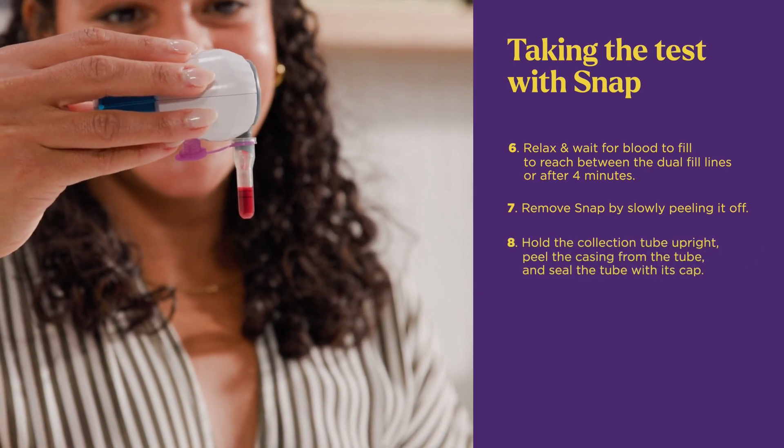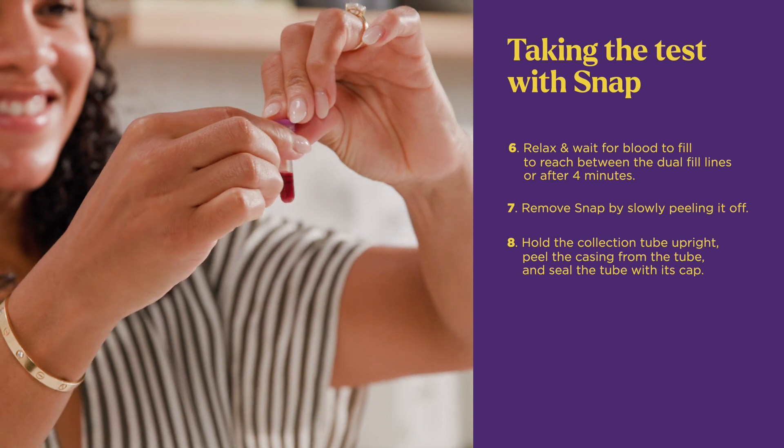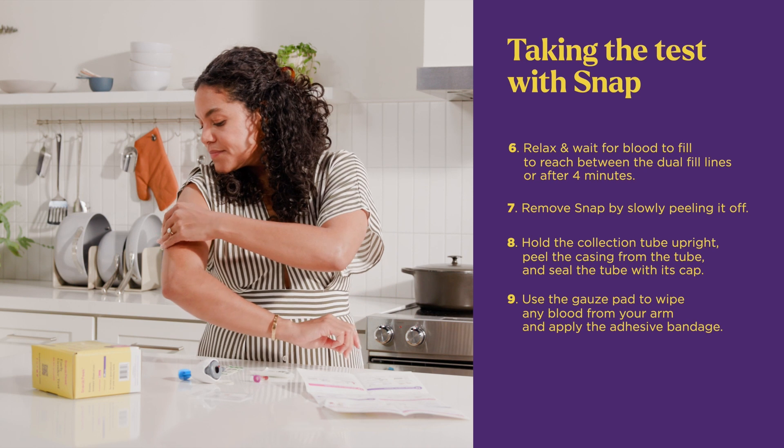Hold the collection tube upright, peel the casing from the tube, and seal the tube with its cap. Then use the gauze pad to wipe any blood from your arm and apply the adhesive bandage.